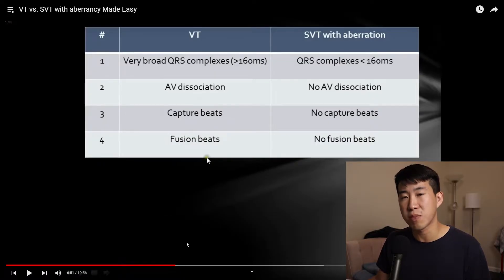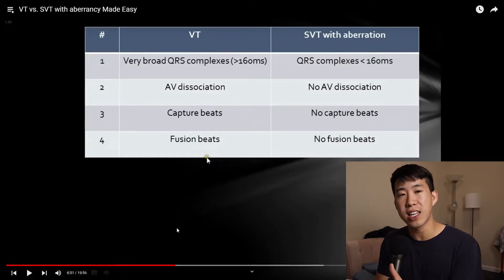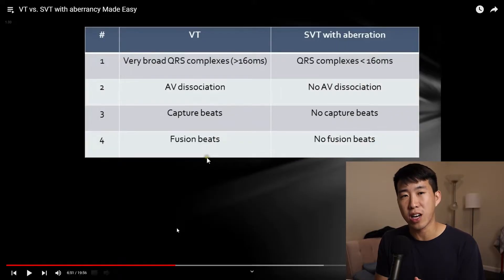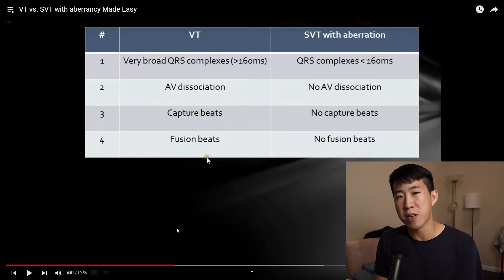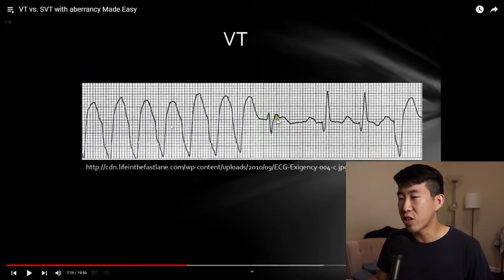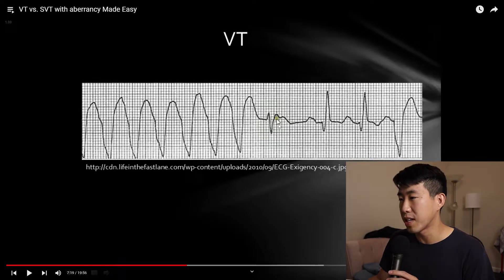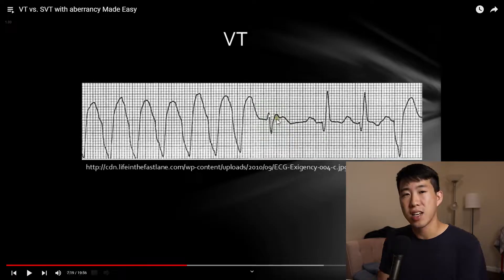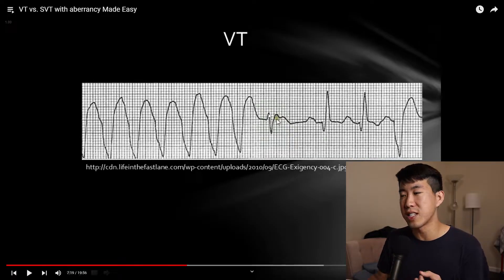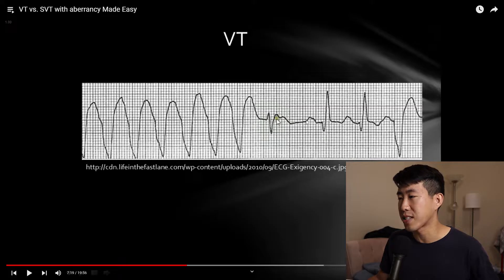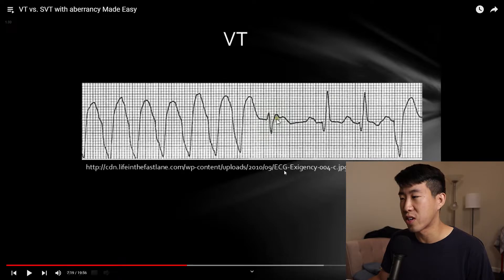Fusion beats are similar to capture beats, but this time the atria and ventricles depolarize at the same time, resulting in a hybrid complex that's between a normal QRS and the bizarre wide QRS of VTach. So in this scenario, we have multiple beats of VTach, and then suddenly this intermediate QRS complex — a fusion beat — because the atria and ventricle are depolarizing simultaneously. Following that, you can see two capture beats, which look mostly like normal QRS complexes.